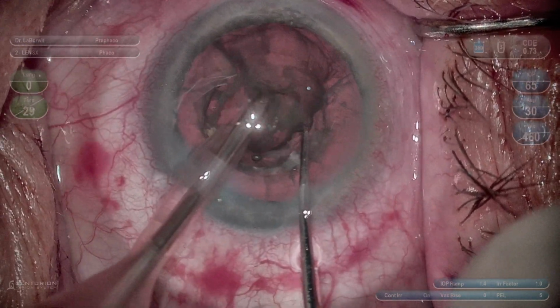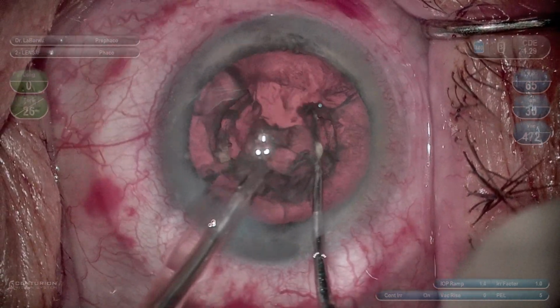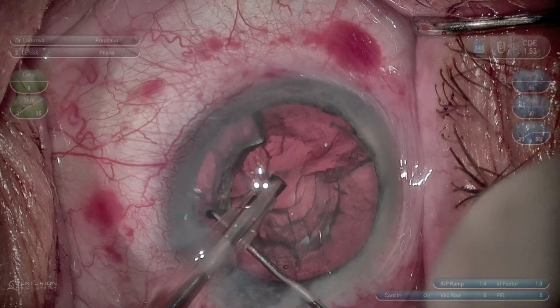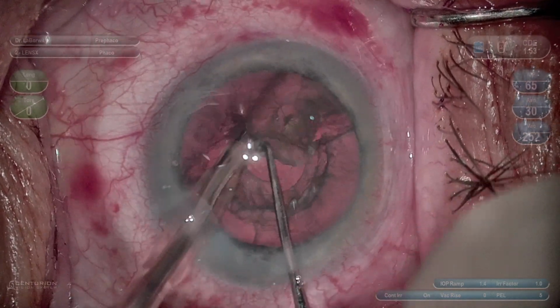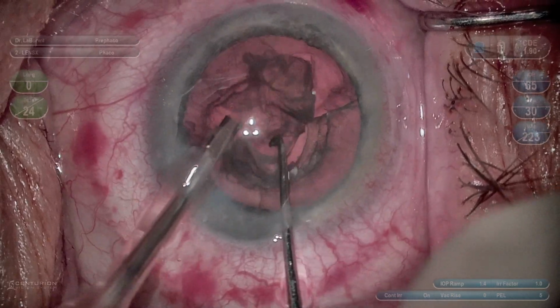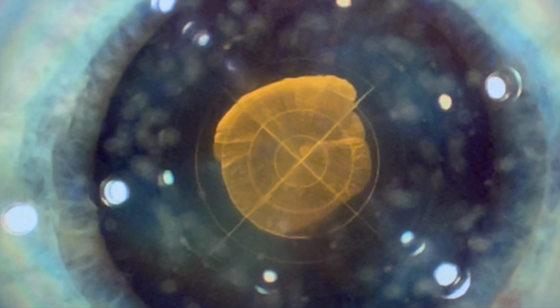And the phaco tip is acting like a third instrument, but when it's actually being used, it's flat, not angled down, and in the middle in a safe area. Again, here's evidence that the laser's doing the work, because you can see these quadrants are laser cut, known sizes, with straight lines on the edges. You can see in this very dense lens, the CD is under 2.5 at this point.